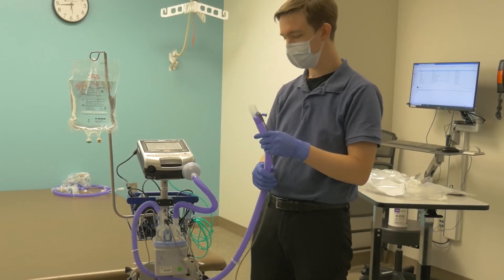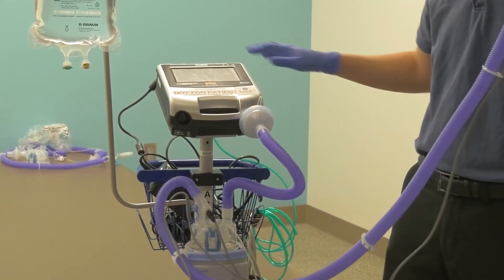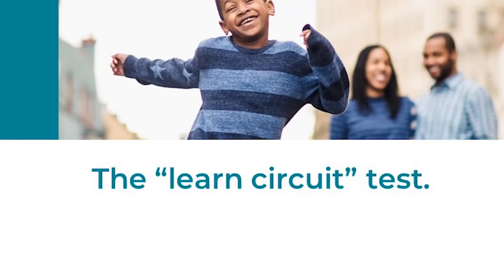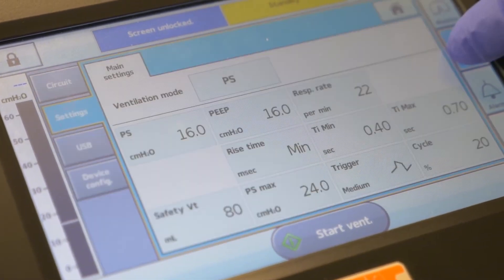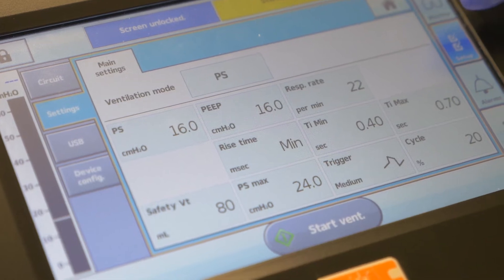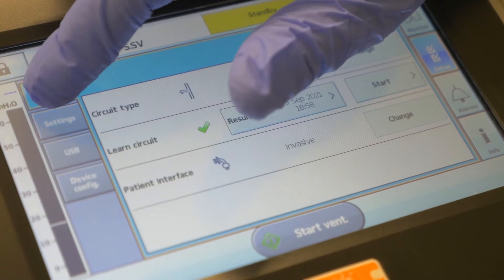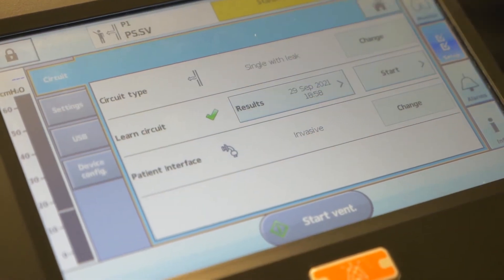Once you've gotten this far, the circuit should look like this. Next, you must do a learned circuit test before connecting anything else to the circuit. To get to the circuit test, move to your touch screen. Press the setup option visible on screen — the correct option looks like two check marks. After pressing setup, follow the blue marker across the screen to the left side and press the circuit option.